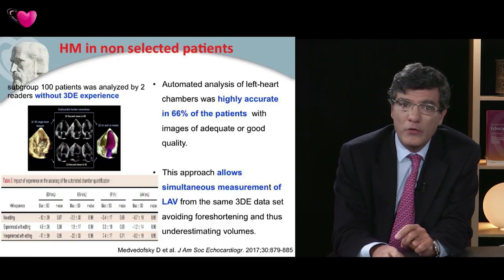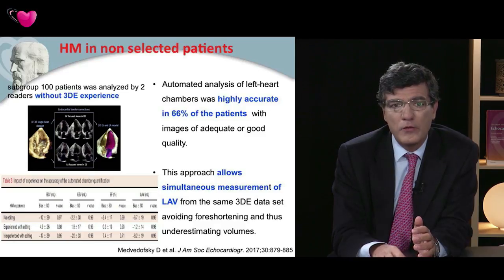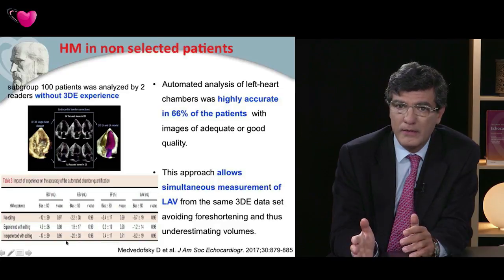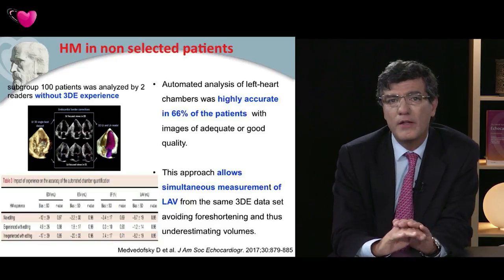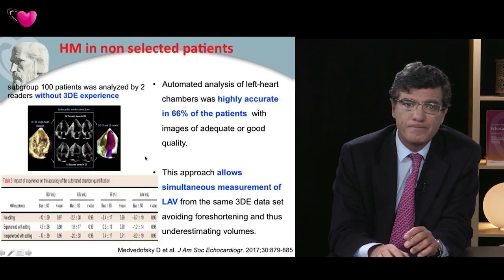Well, in fact, you can see that the system is still very accurate. In most of the patients, the system provides very accurate data with an extremely high correlation. And that holds in selected, non-selected, optimal acoustic window, suboptimal acoustic window patients, or even if you don't have any excellent experience with 3D echo.